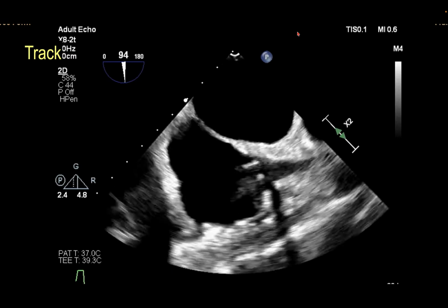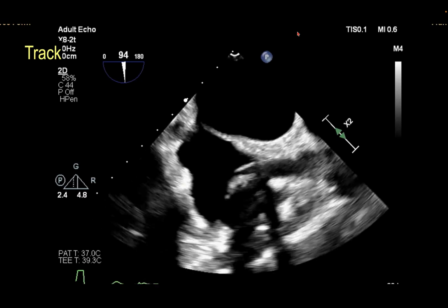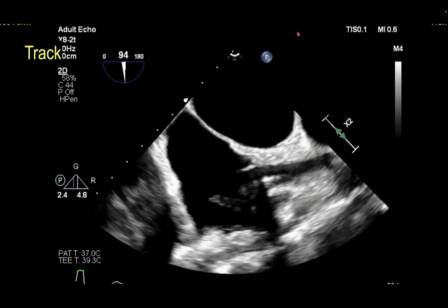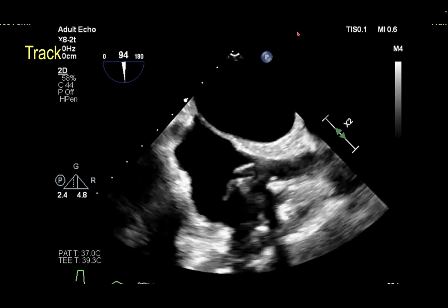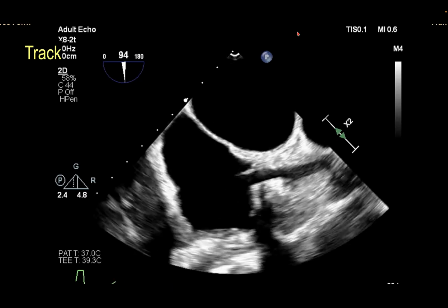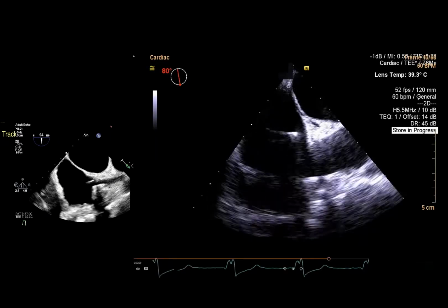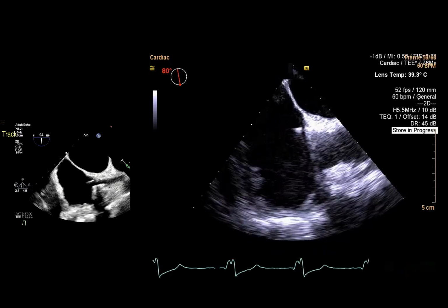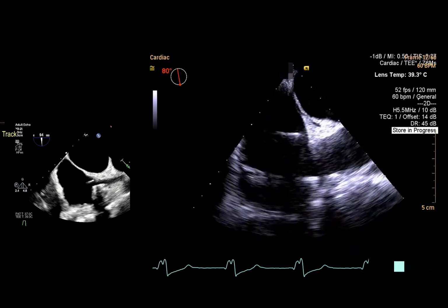That's a great point, because the ultrasound plane can cut the needle at any cross section, which can erroneously appear to be the tip of the needle when it is not. The tip may be extending beyond what we think is the tip, and we can inadvertently puncture the septum at a location which is not ideal or unsafe. While we do not see it in this one, the reverberation artifact of the tip of the needle, and a lack of image beyond that, is something I have used in the past.